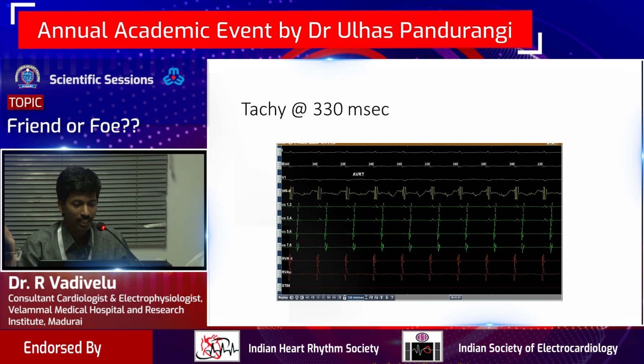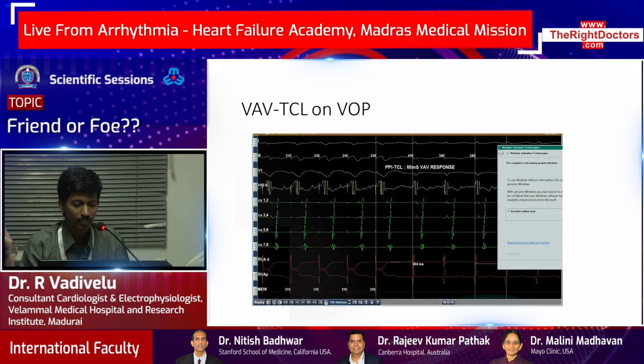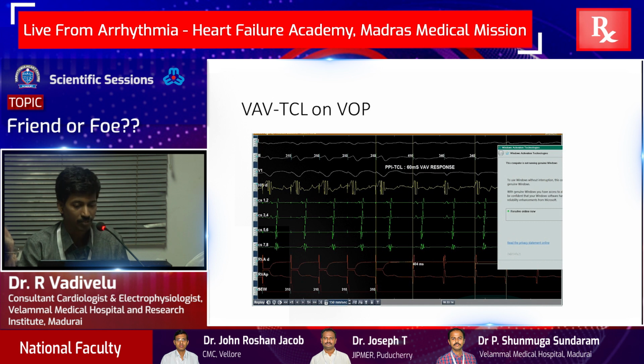The tachycardia cycle length was 330 milliseconds, and we did some maneuvers, though it may not be essential. This is the VOP showing PPI minus TCL, tachycardia cycle length, around 60 milliseconds, and obviously it is a VAV response.